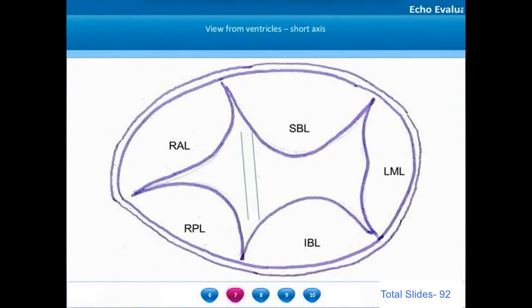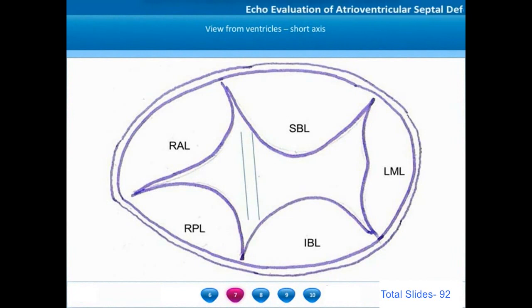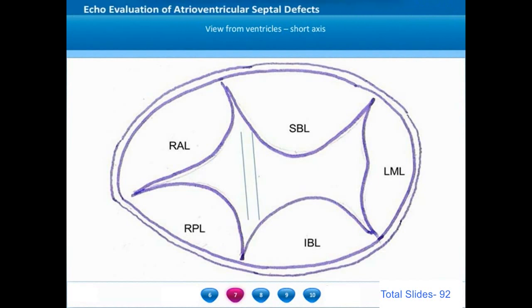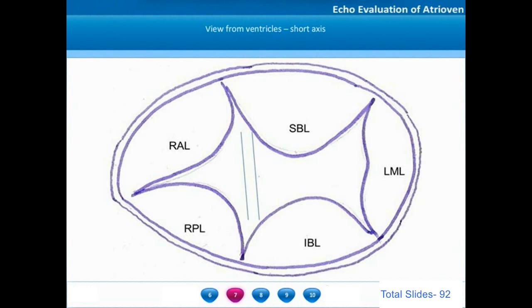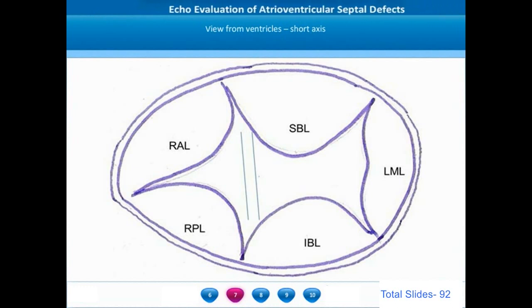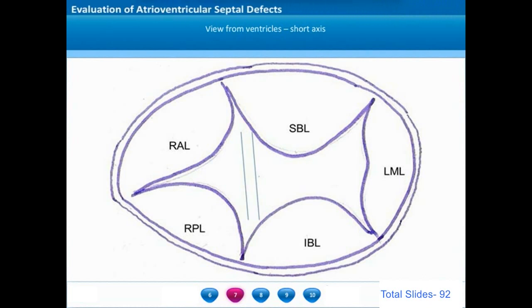A complete AV septal defect is formed of five AV valve leaflets. The superior and inferior bridging leaflets are the two major leaflets that bridge the atrioventricular valve. On the left side you will have the left mural leaflet, which is the equivalent of the posterior mitral leaflet in a normal heart. On the right side you will have a right anterior leaflet and a right posterior leaflet.